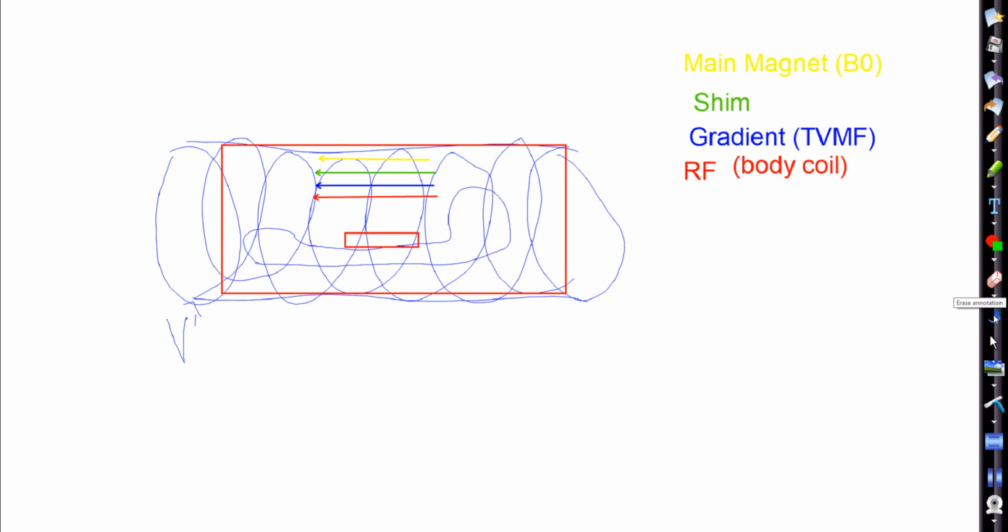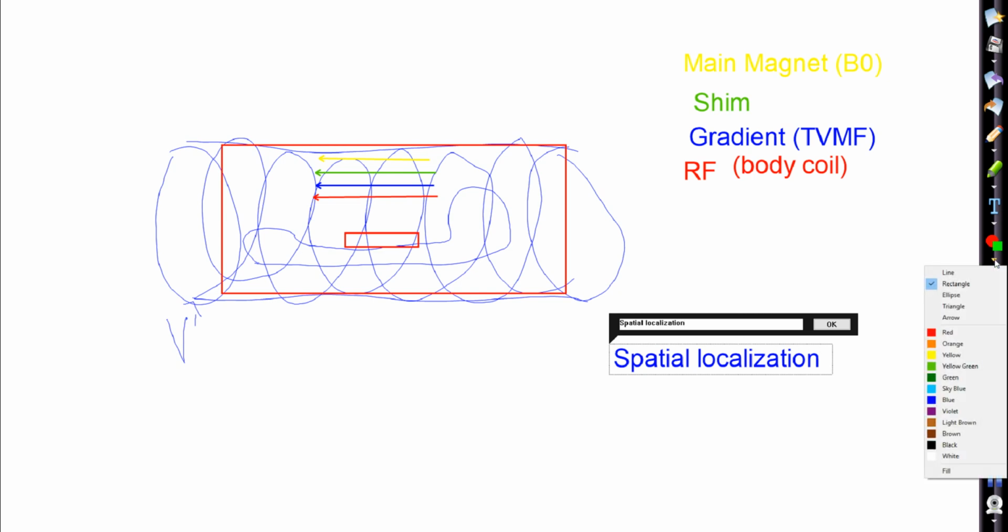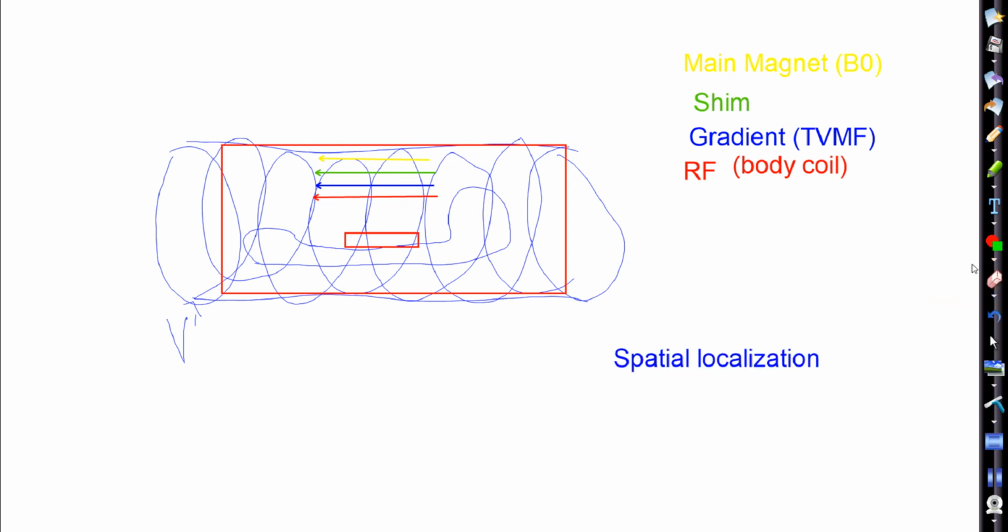Gradient coils. What do the gradients do? What's their main responsibility? I'll put it down here. What is the main responsibility of our gradient coils? Spatial localization. This is where we're applying those gradients in all three orthogonal planes.